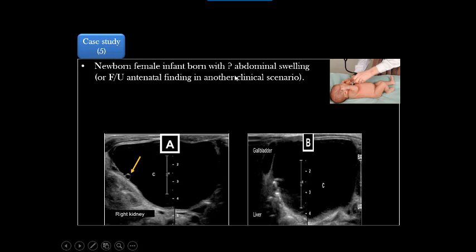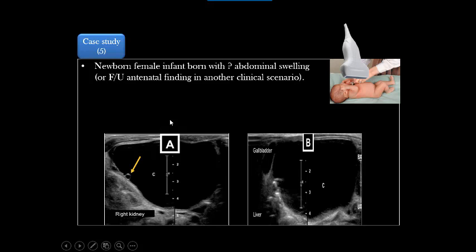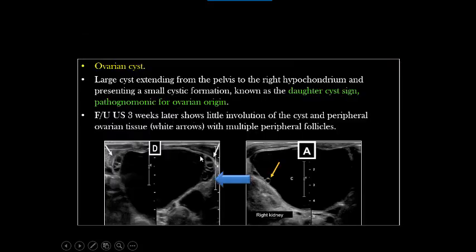Starting our cases. The first: a newborn female child with suspected abdominal mass — either detected by the clinician or mother, or the other common scenario is an antenatal suspected pelvic abdominal mass coming for postnatal follow-up. We see a large pelvic abdominal cystic lesion reaching down to the uterus and urinary bladder and up to the gallbladder, liver, or kidney. The commonest cystic mass in a female fetus or female neonate is an ovarian cyst. The classic finding here is a daughter cyst — which is pathognomonic of ovarian origin.